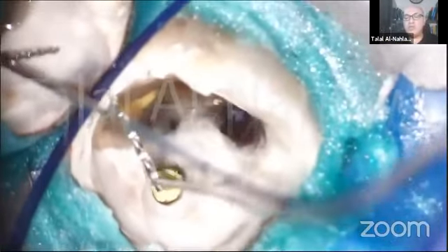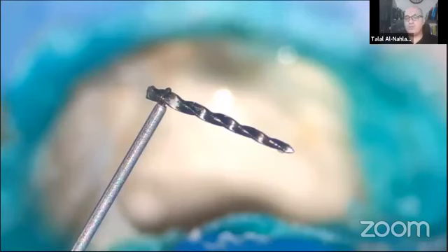and I'm trying to make some movement. I was successful in removing the broken file, and I removed it with the loop device BTR. You can see that I was able to expose only the 1 millimeter. Then I get it with the loop device and I remove it.